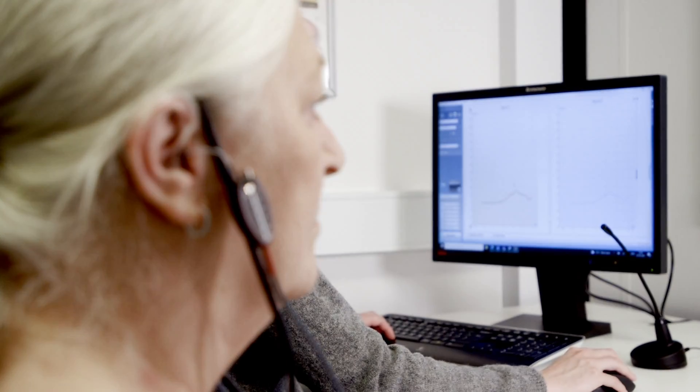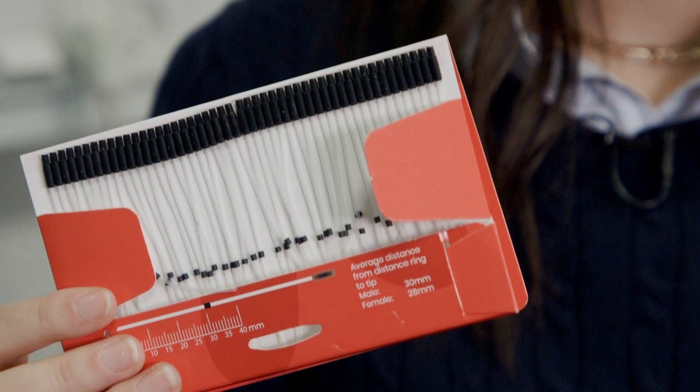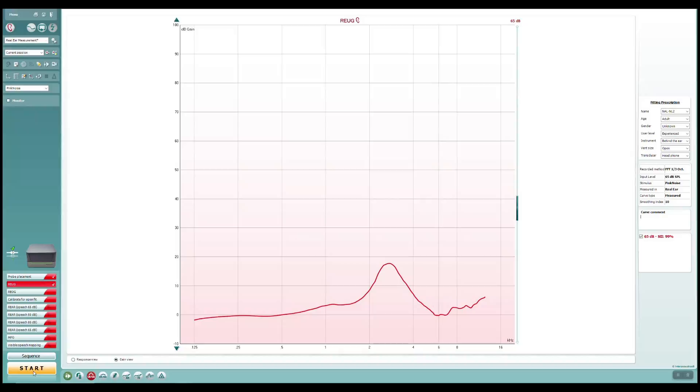It is important for the quality of your real ear measurements that the probe tube is placed at the correct depth. This is how you can estimate correct probe tube placement using otoscopy, black marker placement, and a real ear unaided gain measurement.